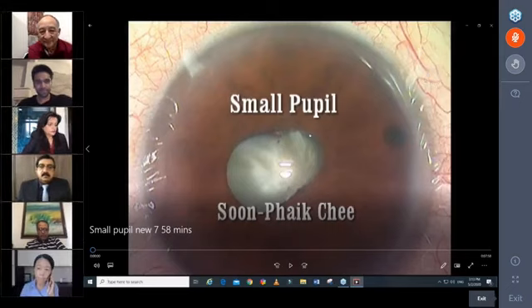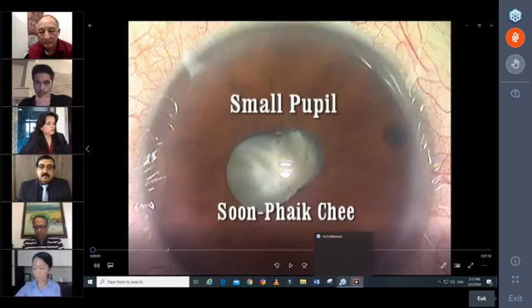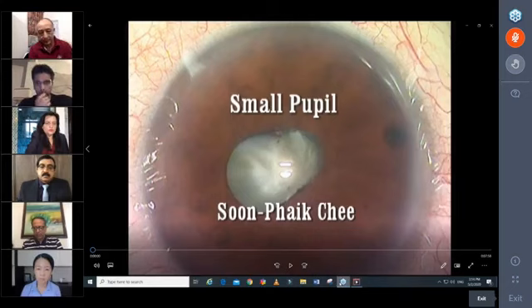If you don't have the Femto, Dr. Prakash actually had a very good tip. When you're doing the CCC, you can do it like a reverse traction. The pediatric ophthalmologists do that. So they make the CCC pulling actually in the opposite direction. And that is much better, much less likely for that CCC to go out and become an Argentinian flag. Right.